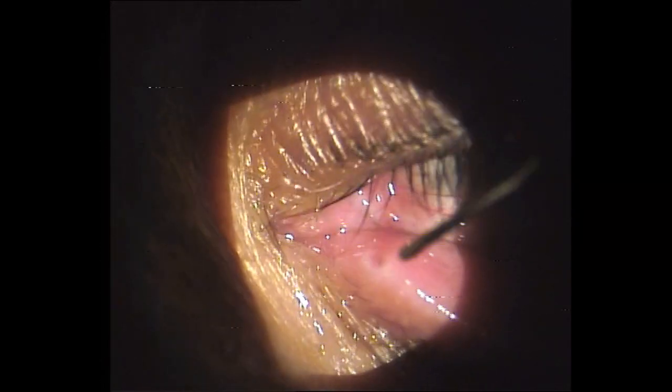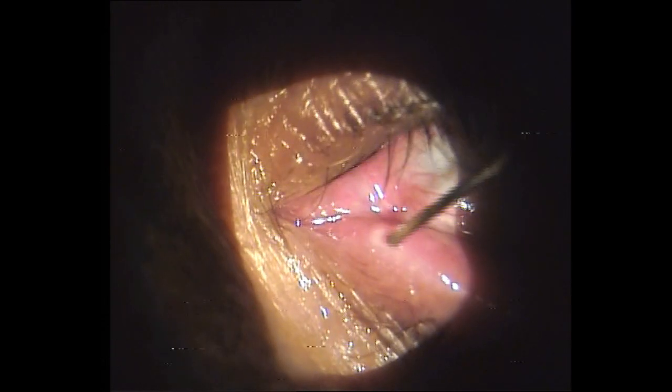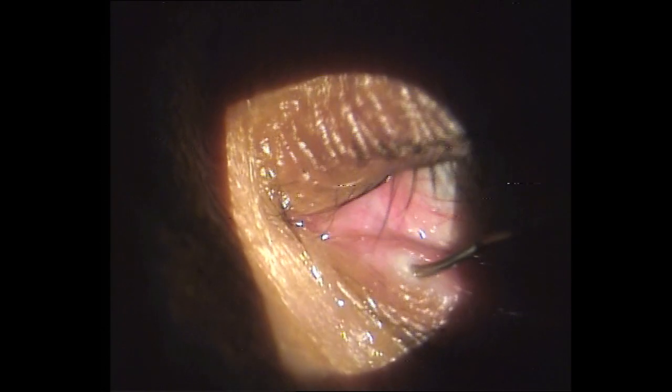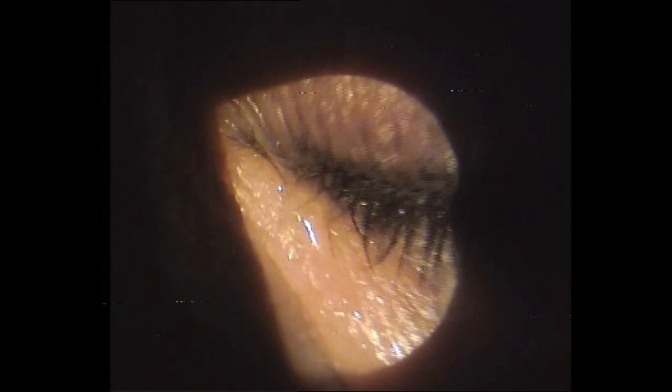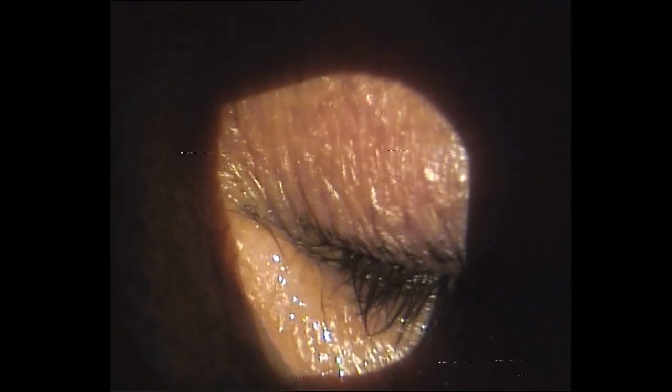So I did not do any probing. I'm just doing punctum dilation, and then you do syringing. And here as well, there's good flow through the lacrimal system, and the patient felt there might be a little less fluid, so I just did it again, and then the patient felt it was the same on the other side. So the important thing is we found out that the nasolacrimal duct was open in this patient.